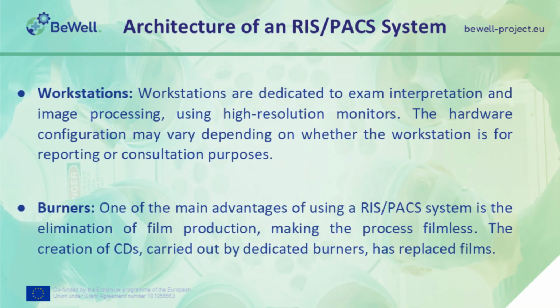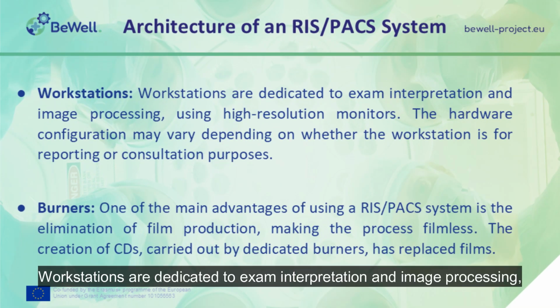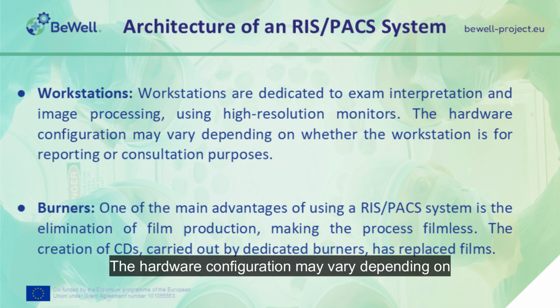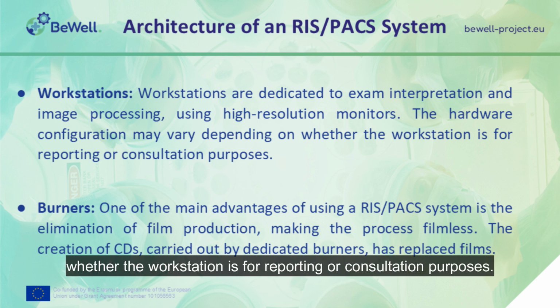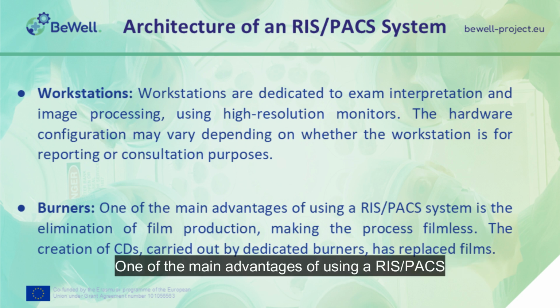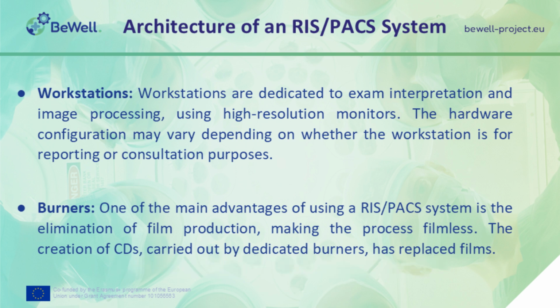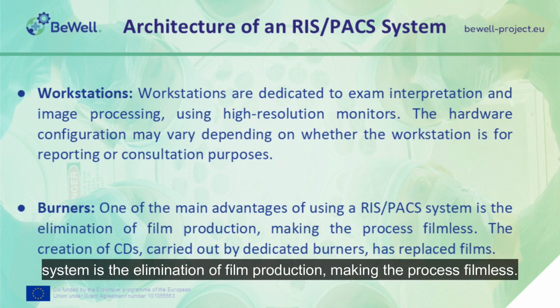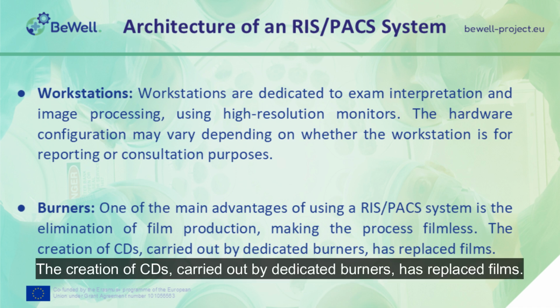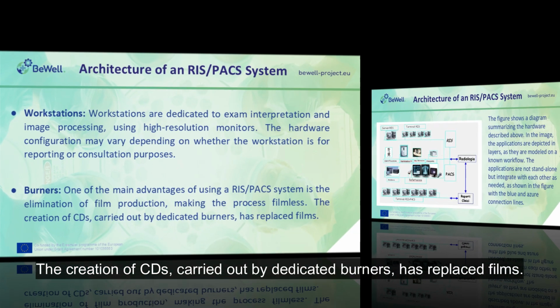Workstations. Workstations are dedicated to exam interpretation and image processing, using high-resolution monitors. The hardware configuration may vary depending on whether the workstation is for reporting or consultation purposes. Burners. One of the main advantages of using a RIS PACS system is the elimination of film production, making the process filmless. The creation of CDs, carried out by dedicated burners, has replaced films.